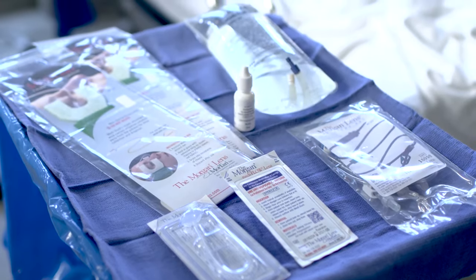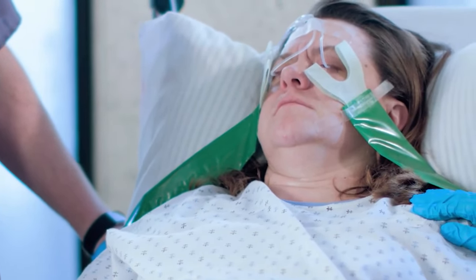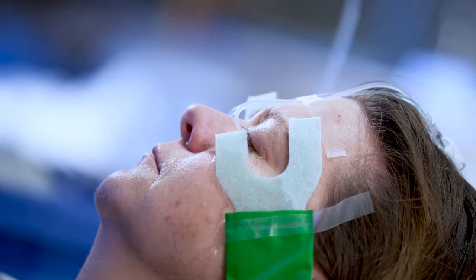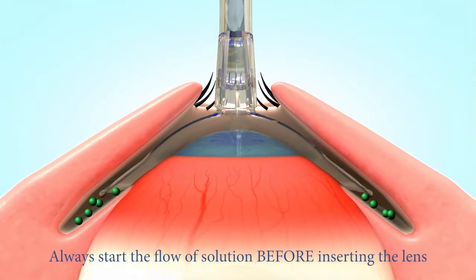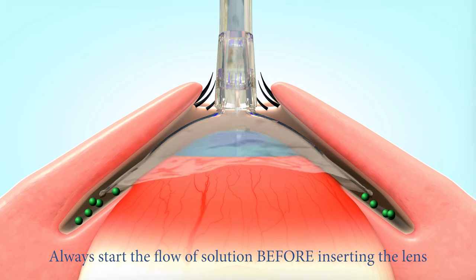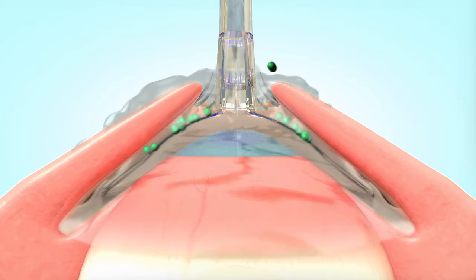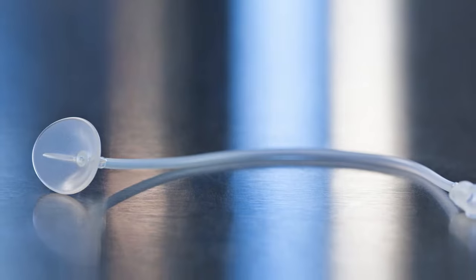No other method of eye irrigation is as simple or as effective. Traditional methods of eye treatment are inefficient and ineffective. Non-embedded foreign bodies, even the kind that can't be seen, are removed effectively and thoroughly. The Morgan lens is the only device to provide a positive and multi-directional flow throughout the cul-de-sac, keeping the cornea, conjunctiva, and normally untreated inner eyelids thoroughly flushed.